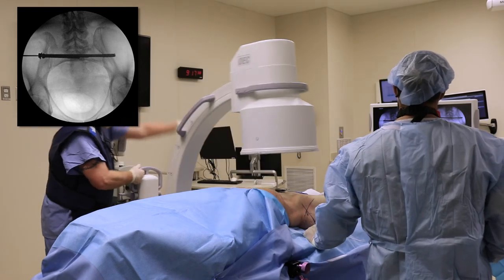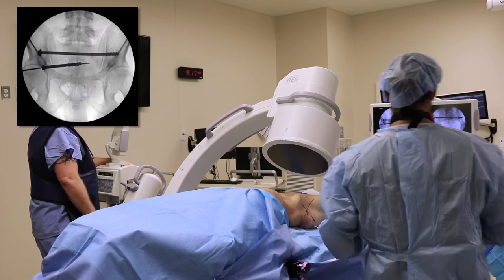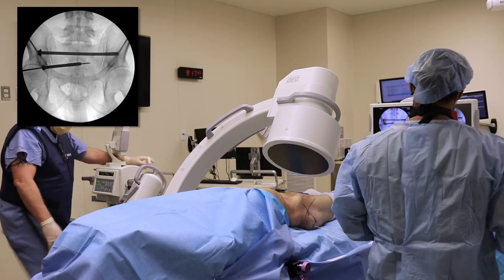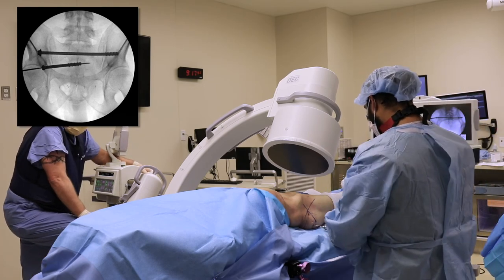You again check it on the outlet. The S2 screw is a little close to the S1 foramen on the right. The guide wire is then removed.